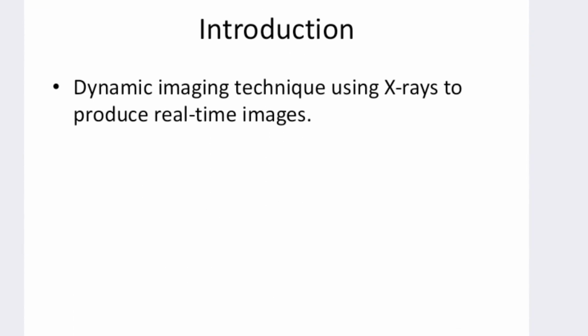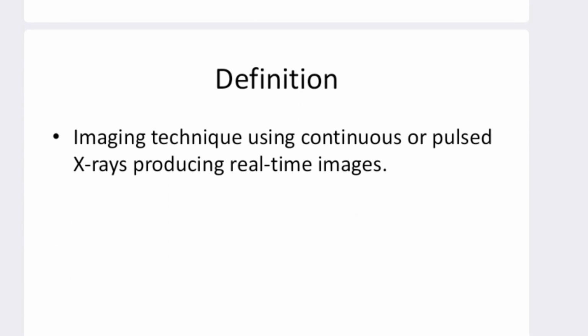First is the introduction. What is actually fluoroscopy? Fluoroscopy is a dynamic imaging technique that uses X-rays to produce real-time images. That is, live images can be captured during the fluoroscopy procedure. The definition: it is an imaging technique which uses continuous or pulsed X-rays and produces real-time images.